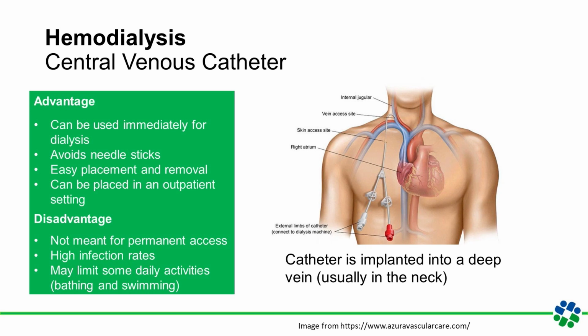However, a CVC is not typically recommended for long-term dialysis due to several drawbacks. The most significant concern is the elevated risk of infection. As the catheter is a foreign object to the body, it can become a site that attracts bacteria, leading to potential infections. Furthermore, it can cause a condition known as central vein stenosis, where there is narrowing of the blood vessels, which could complicate future access options and future possibilities.